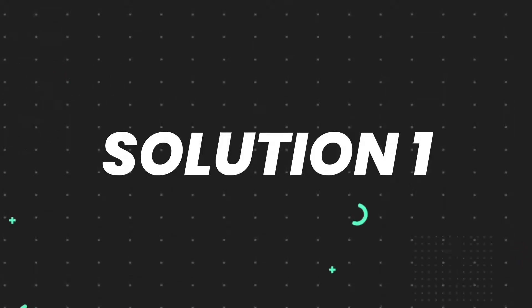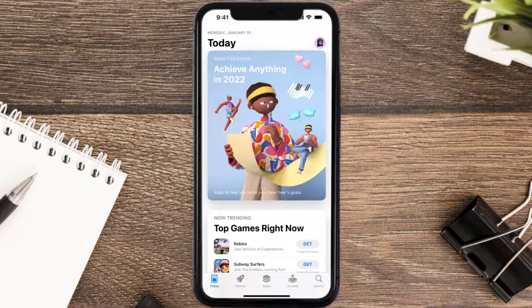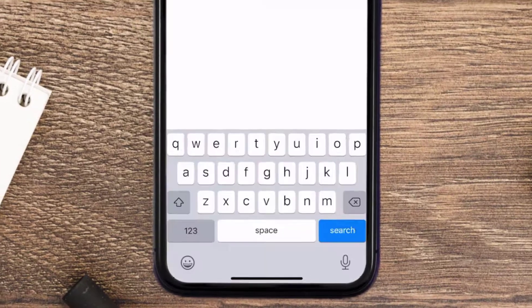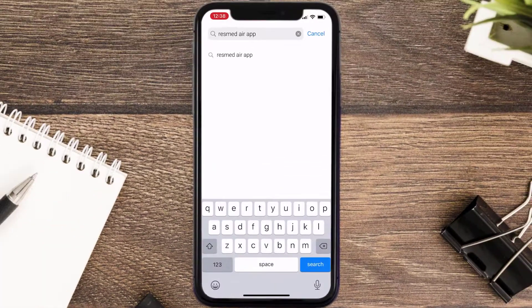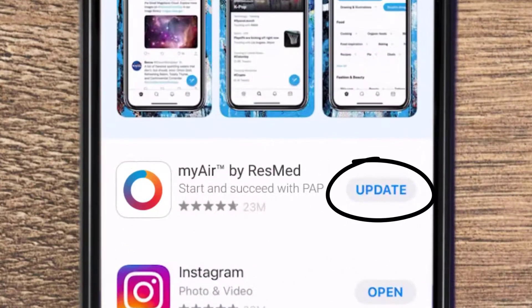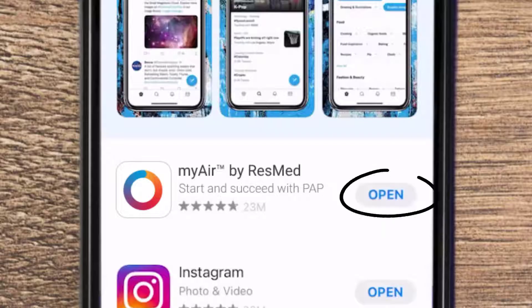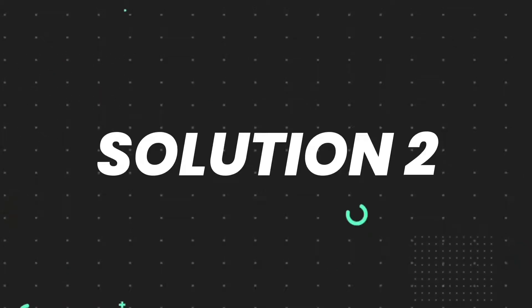First of all, you need to make sure you're running the latest version of the app. Open up the App Store on your device and then tap on the search icon in the bottom right corner. Search for the app, and if you see an update button right next to the app name, simply tap on it to make sure you're running the latest version. But if you still encounter this issue, move on to the next step.